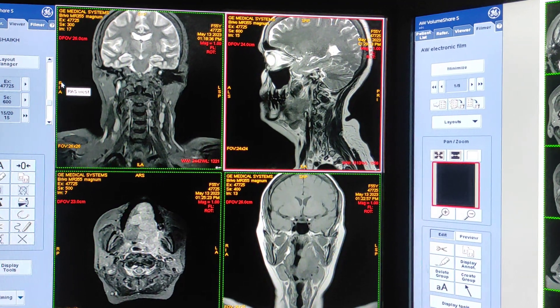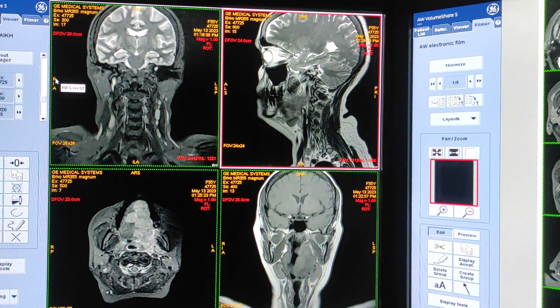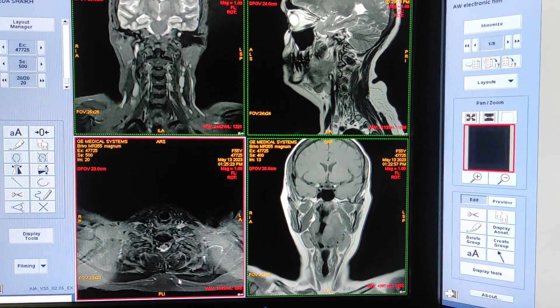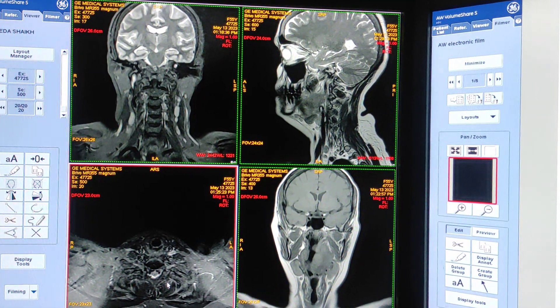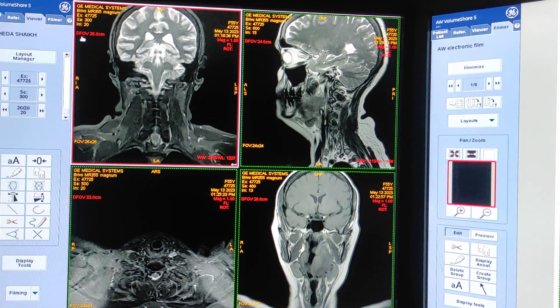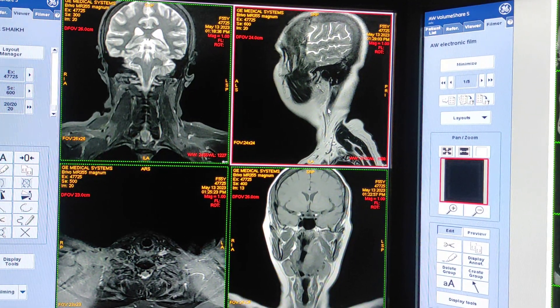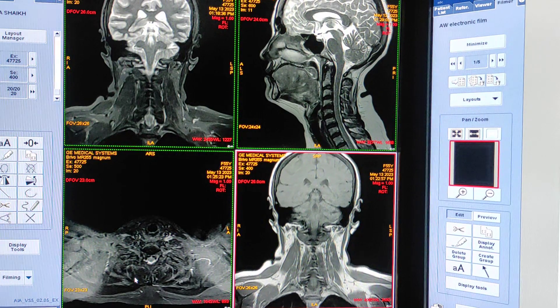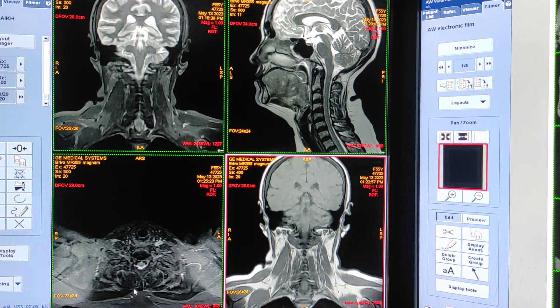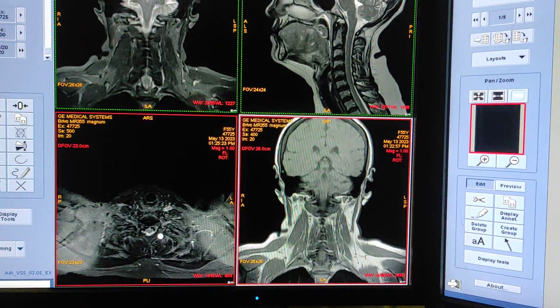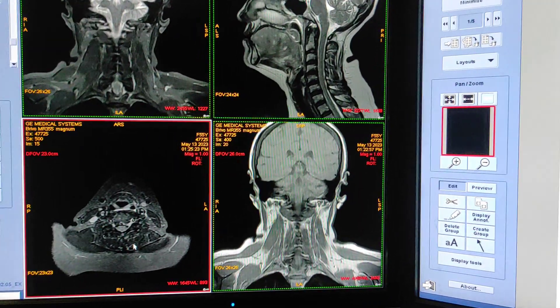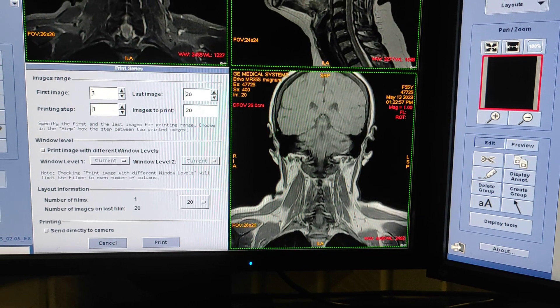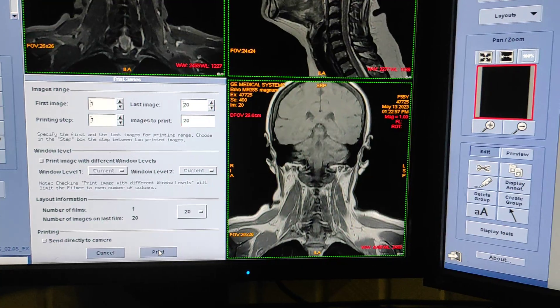First we will see how many images we have taken, and according to that we have to set the format of the films. We have 20 images for axial STIR, 20 for coronal STIR, 20 for SAG T2, 20 for coronal T1. Similarly, axial post-contrast 20 images, coronal post-contrast 20 images, and sagittal post-contrast 20 images. Click on the box, press F4 — everything is already set to 20-image format — then click print directly.